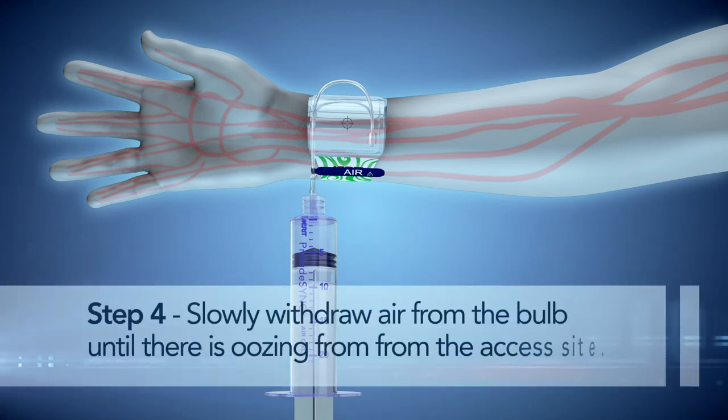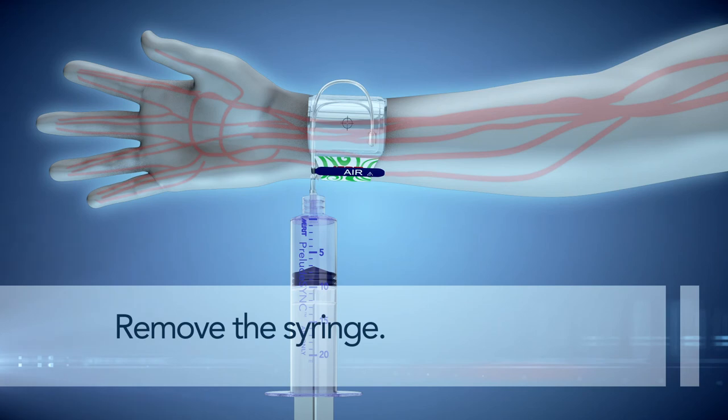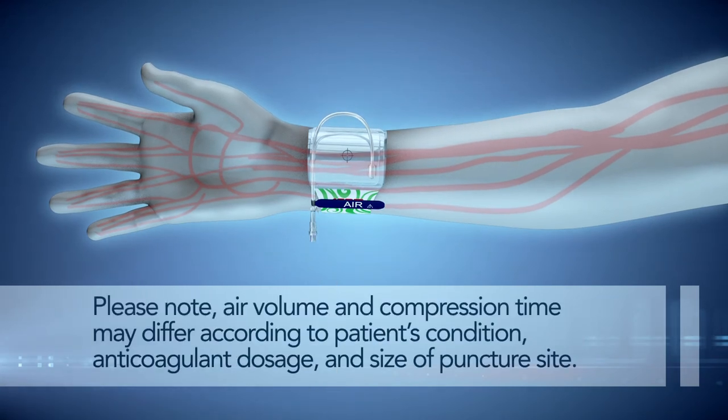Step 4. Slowly withdraw air from the bulb until there is oozing from the access site. Once oozing is observed, re-inject 2 ml of air into the bulb until hemostasis is achieved. Remove the syringe. Please note: air volume and compression time may differ according to the patient's condition, anticoagulant dosage, and size of puncture site.